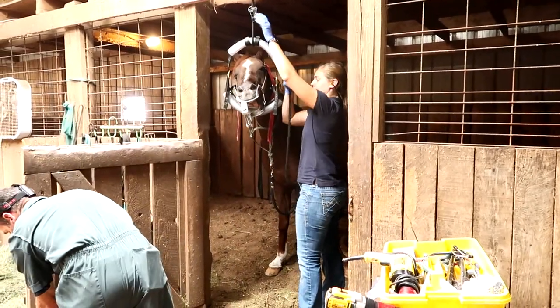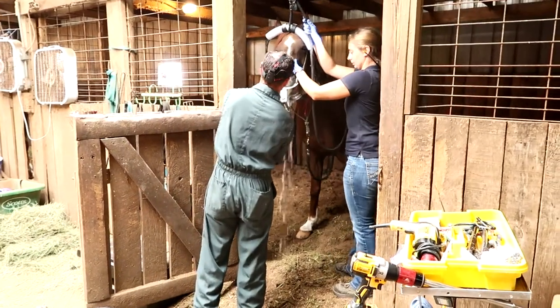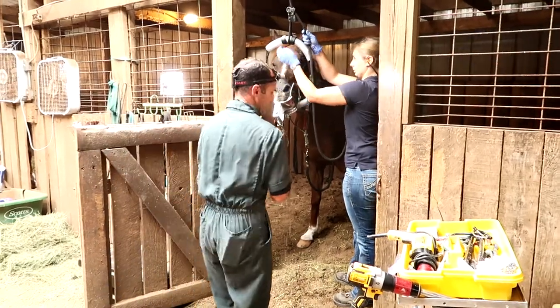Tino's just getting his mouth rinsed out to get rid of any of the sharp bits that Dr. Scott has filed off with the big drill, and then he's going to switch to a smaller drill just to fine-tune what he's been working on.